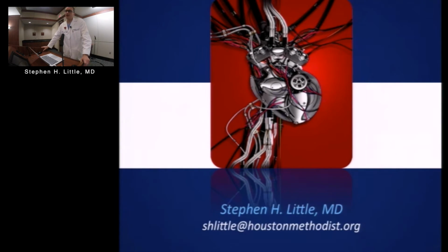Well, it really depends on the size of the valve that you're going into. Most prosthetic mitral valves are pretty large. They're not limited by a small annulus ever, really. So if you're going into a 25 or a 27 valve, in our case, the gradients have been very respectable. I'd say between 3 and 5, mean. They're good. And they're probably closer to the normal function of the prosthetic valve than you would get in an aortic valve-in-valve, because the aortic valve-in-valves tend to be smaller, tend to be much more dependent upon all of that flow area. Mitral valves largely are over-designed.